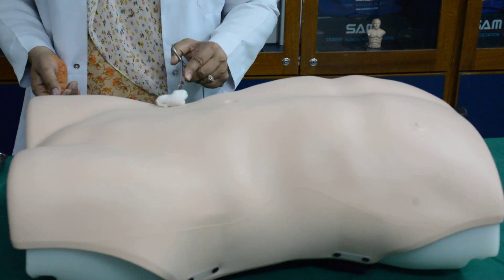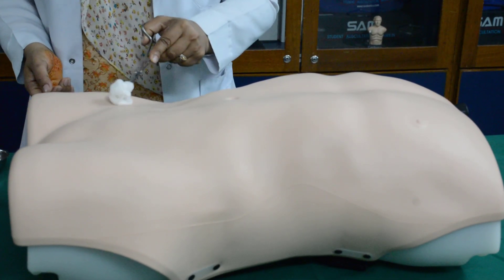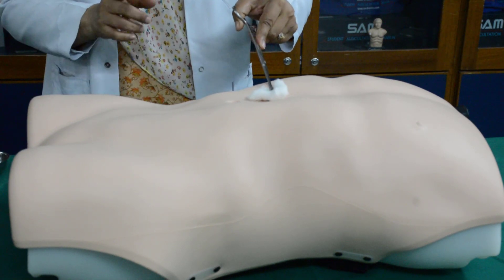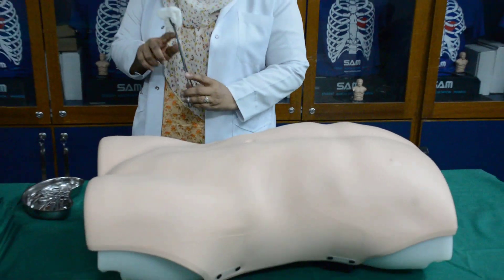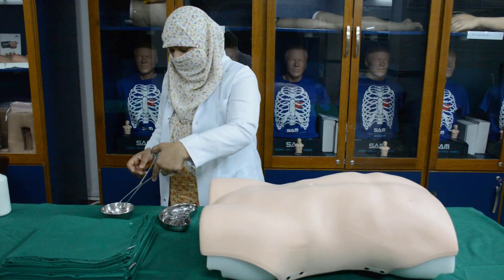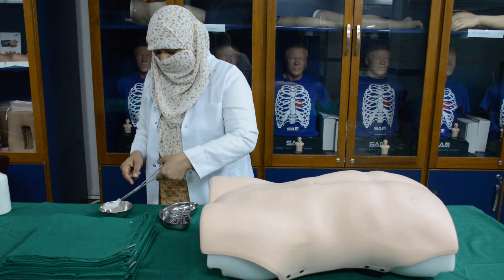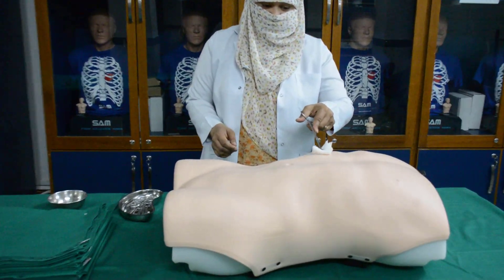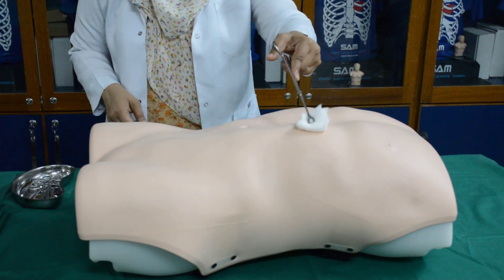You will clean circumferentially outwards, like this. Once the gauze is dried up, you have to throw it away — you cannot put it back on the sterile trolley. Take another gauze, dip it in Povidone iodine, and start again from where you left off, then complete the cleaning.